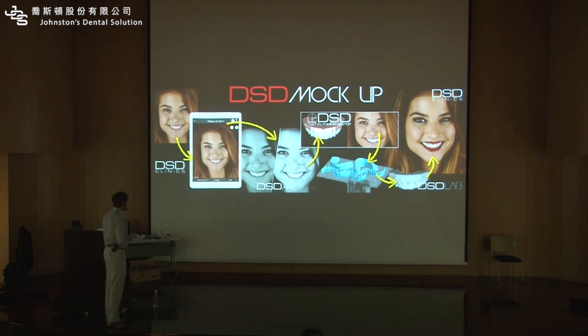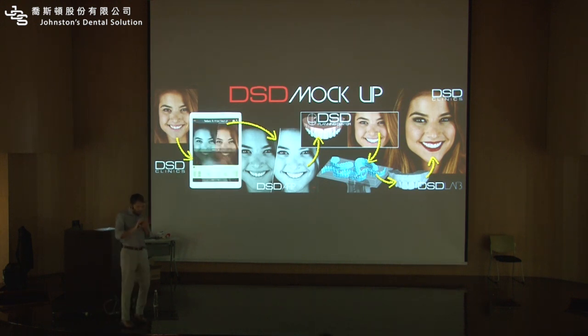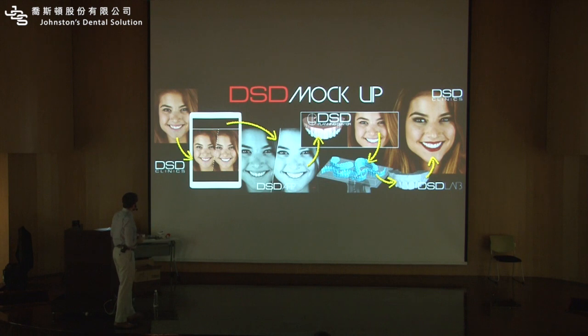Ralph is going to explain later. Okay? So in the app, you also have this part where you can design the before and after. So you can make very cool, fast combinations and present.